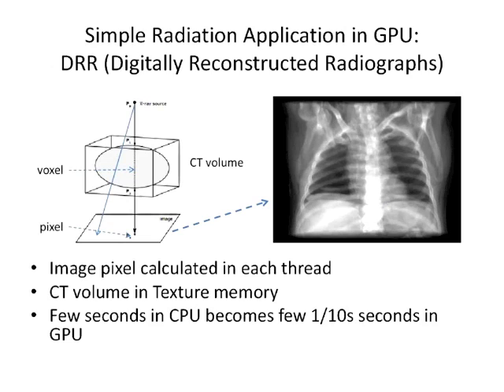So we get close to 15 times speedup compared to a Nehalem core. This one used just one core, not multiple cores. We didn't try OpenMP or MPI. We tried that, but we needed more nodes to get comparable performance. I don't remember what that was.